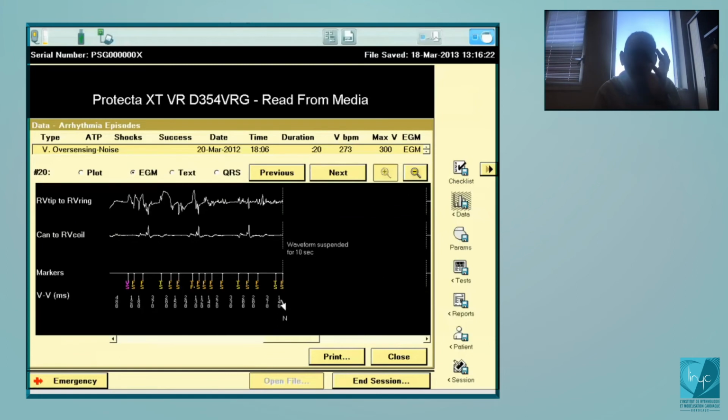So if you work with the LIA and remote monitoring, in most situations you should not need this second algorithm, because this one will work once the counters are full. And once more, the idea of detecting and preventing inappropriate therapy is to arrive at the diagnosis of lead dysfunction way before your counters are full.